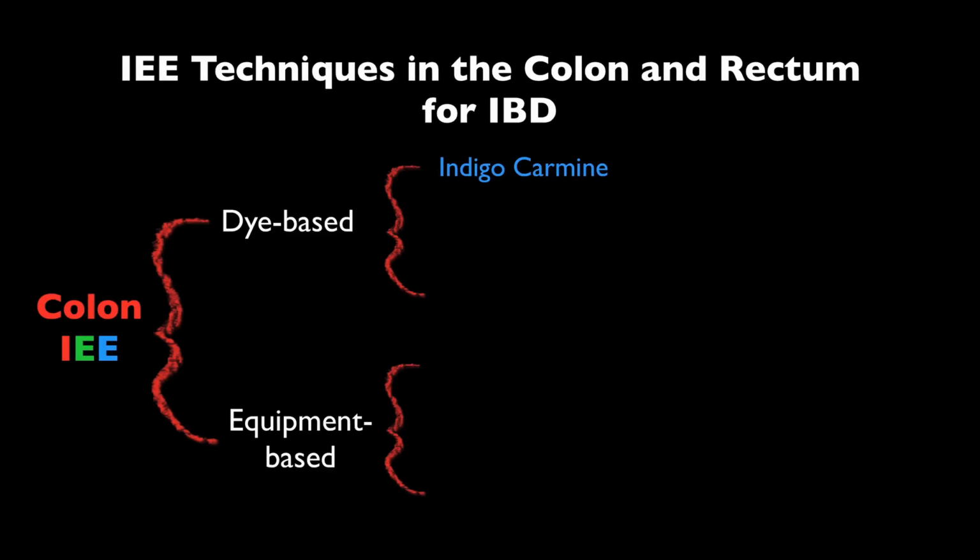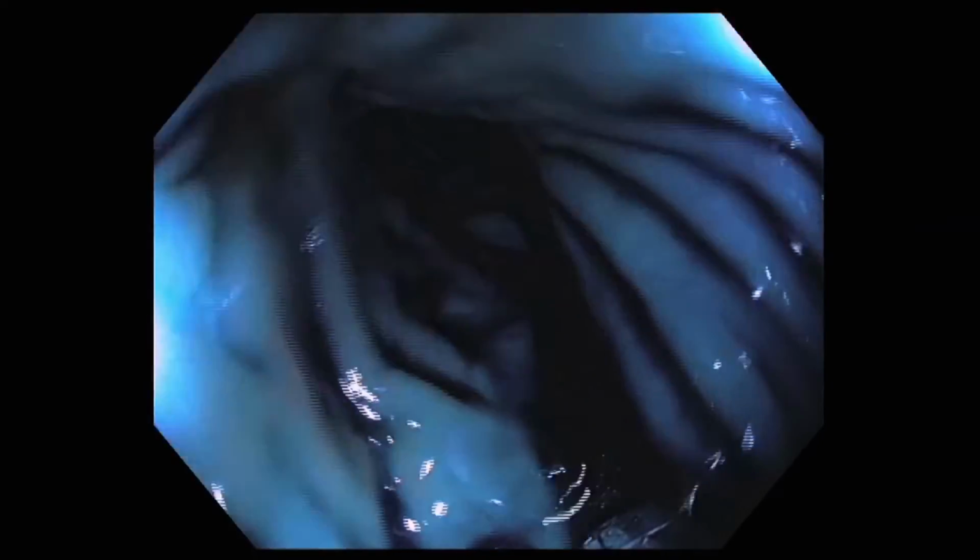In vivo studies of colonic and Barrett's esophageal mucosa have demonstrated increased risk of DNA damage and further carcinogenesis in rat stomach models. Furthermore, because methylene blue is a vital dye, the cells take up the dye, making it technically more difficult to use. The mucosa remains stained, making the field darker and more difficult to visualize.